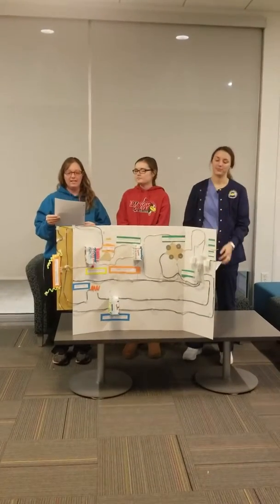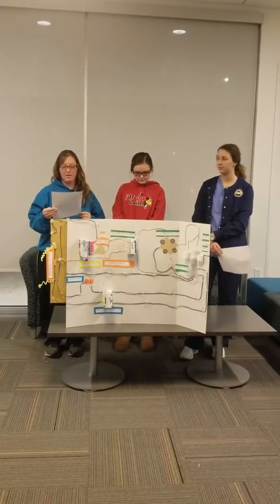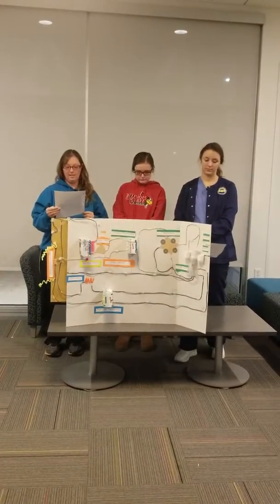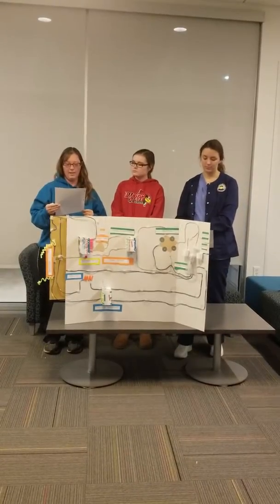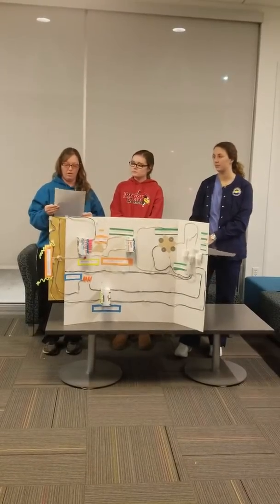Next is the secondary circuit. It begins with the rest of the step-up transformer. A milliampere meter is placed here to monitor the X-ray tube current. Rectifiers are needed to convert AC to DC. They're made of two semiconducting crystals. One is a P-type and has an abundance of electron traps, and the N-type has an abundance of freely moving electrons.